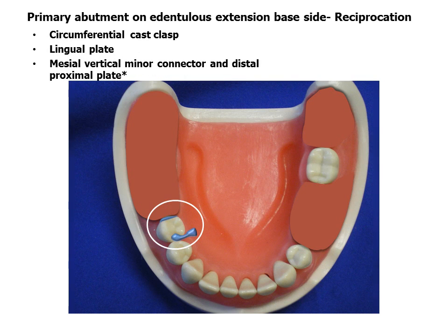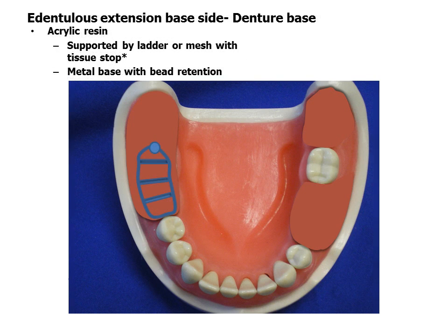The reciprocal element for the primary abutment on the extension base side may be a circumferential cast clasp or plate. The illustration shows a vertical bar minor connector with distal proximal plate, commonly used with the eye bar retainer. The base for the distal extension side in most cases is acrylic resin retained by ladder. In rare instances, metal bases may be used when little vertical space exists or relining is not anticipated. The retainer element contacts the stone cast at the terminal end to support the base during processing.